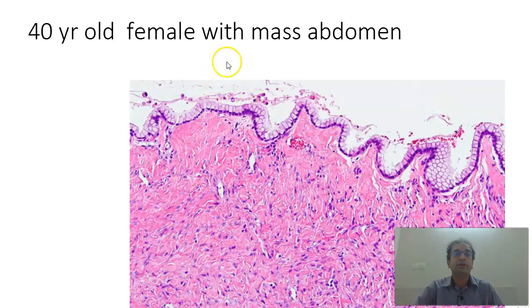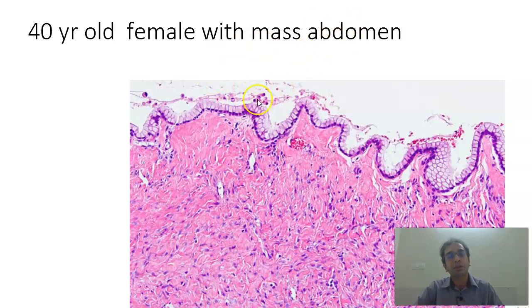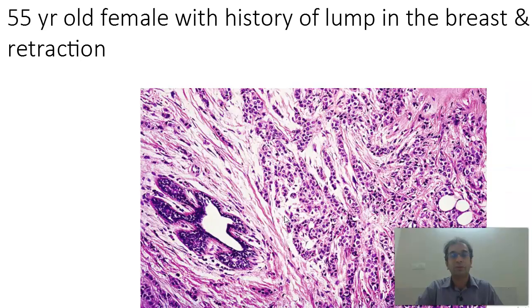Next, a 40-year-old female with a mass abdomen. What you find here is that this is a cyst. Usually in a female patient with mass abdomen, think of the ovary. You have nice mucinous glands at one end and a lot of mucin within them. So this is likely to be a mucinous cystadenoma of the ovary.